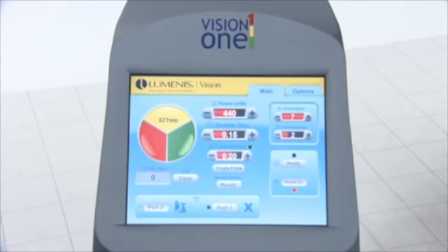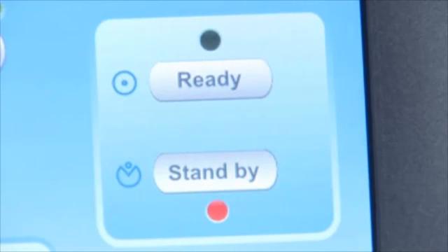If any fault conditions are encountered during the laser self-test and warm-up, refer to the troubleshooting guide in the maintenance chapter of your operator's guide. When the laser is powered on, the laser emission indicator displays on the control screen to provide a visual warning that the laser energy is accessible. The indicator continues to display until the laser is turned off.